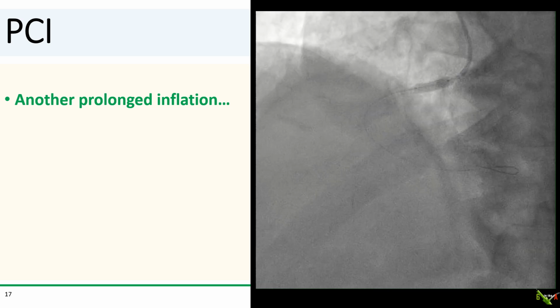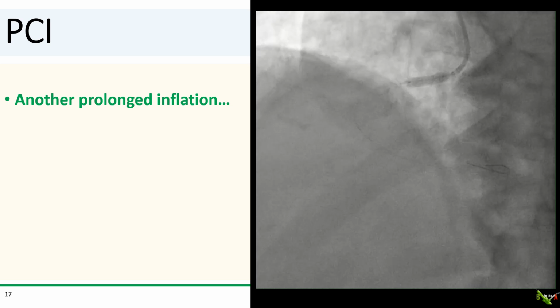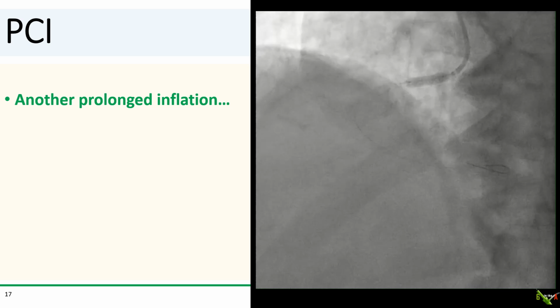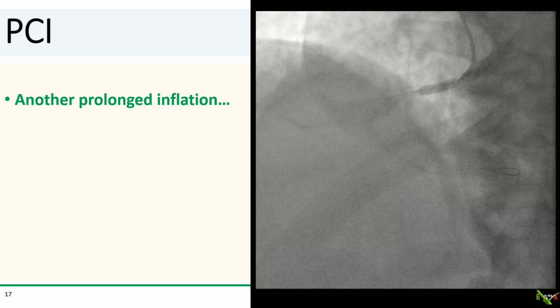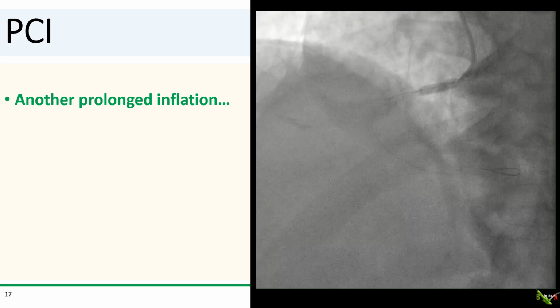So we did another prolonged balloon inflation, another 15 minutes. We did keep anticoagulation going. We still had equipment in the coronary arteries and certainly did not want to deal with coronary or stent thrombosis at this point. And in general, anticoagulation should not be stopped in perforations until your equipment is out of the coronary. I have done a few videos on coronary perforations in which we go through how to handle perforations in greater detail, and I've got some of those links in the comments sections below.